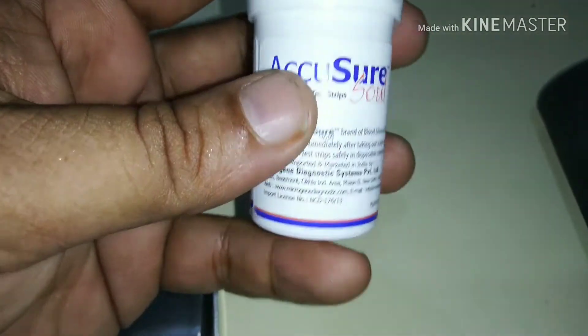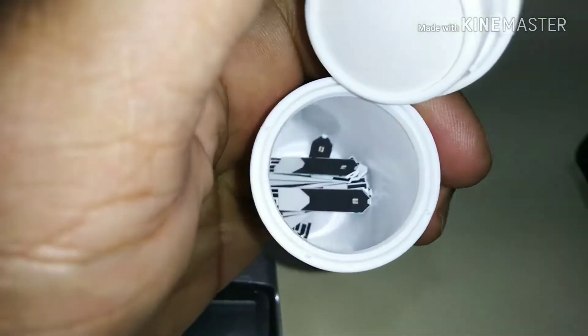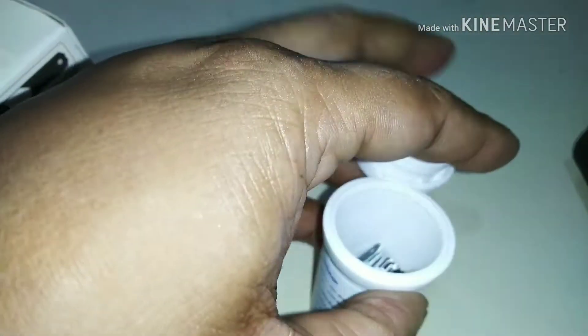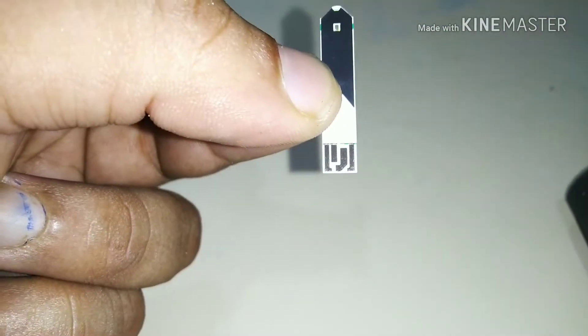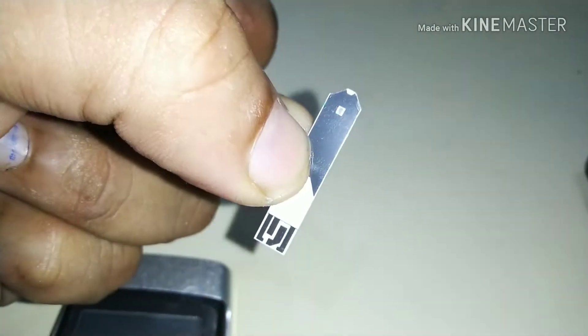This container contains the glucometer strip which is used for the blood sugar machine to read the blood sugar level. The lower part will insert into the machine and the upper dot part will collect the blood.